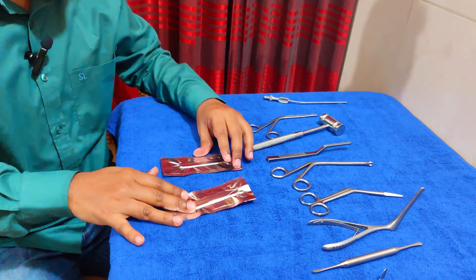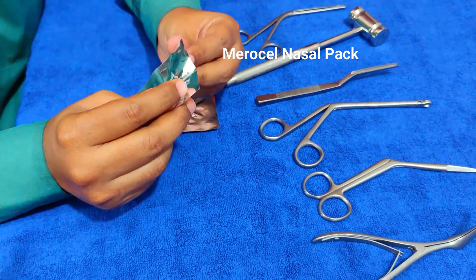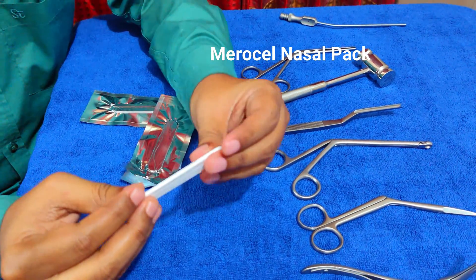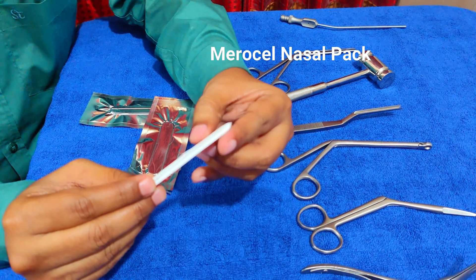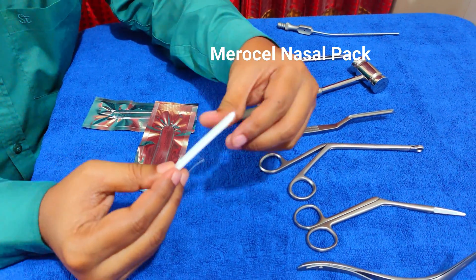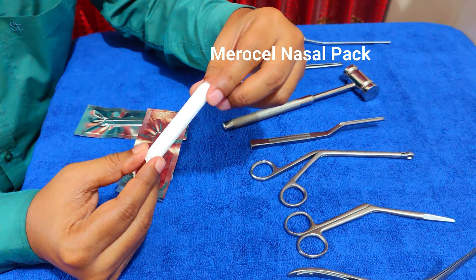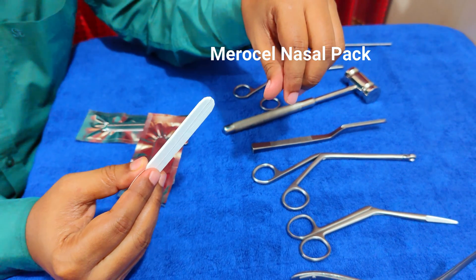These two are Merocel nasal packs. The Merocel nasal pack is a biocompatible pack given at the end of septal surgery. We also give it for epistaxis, and it helps us for atraumatic nasal packing.